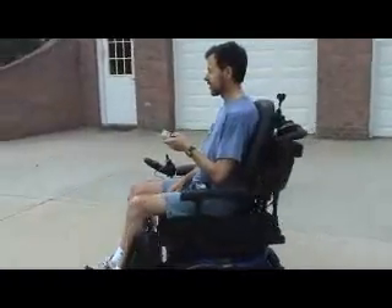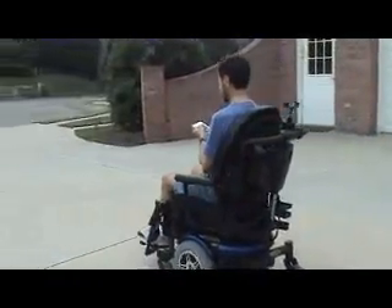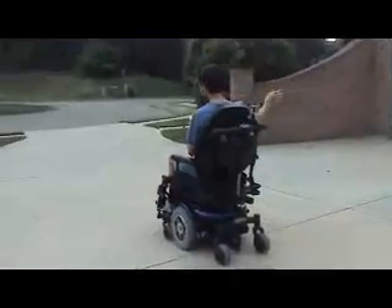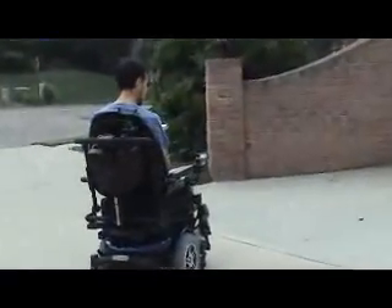Now I'm going to hit the straight ahead button, so we're straightening out now. Now I'm going to hit the right button so that we turn around and make another pass.